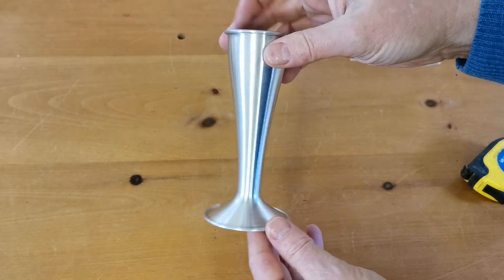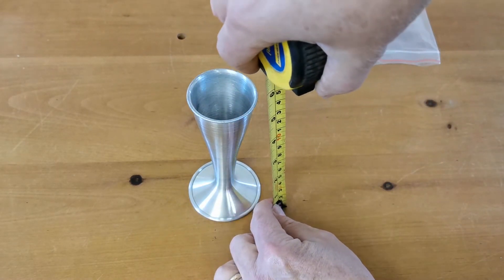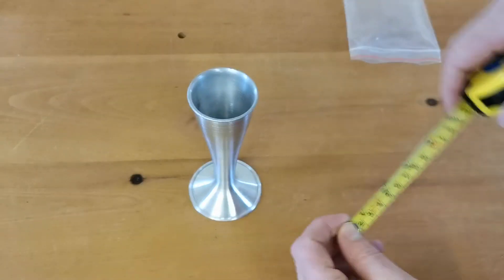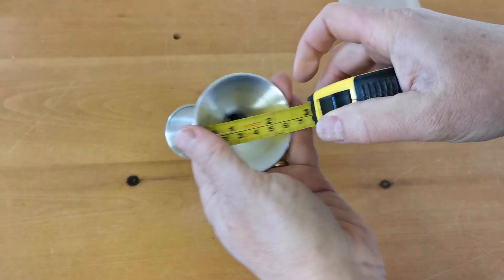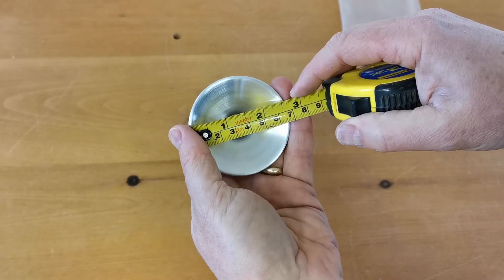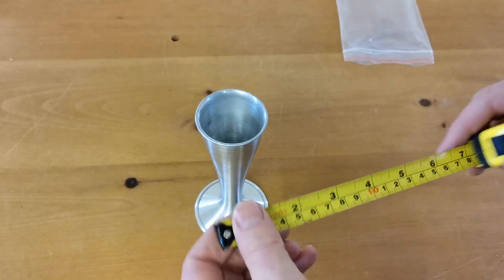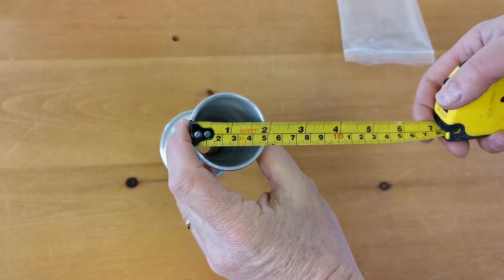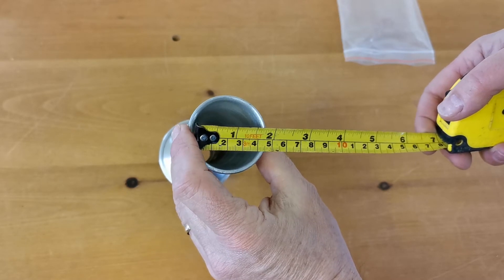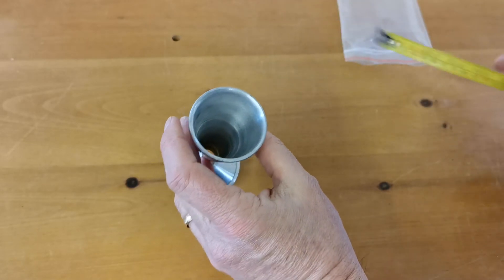The unit dimensions are 14 centimeters — five and a half inches — in total height. The trumpet end or ear end of the unit comes in at approximately six and a half centimeters, just over two and a half inches. The business end for listening, the actual diaphragm, is a two-inch outer diameter, with an inner diameter of about 1.75 inches or just under four and a half centimeters.